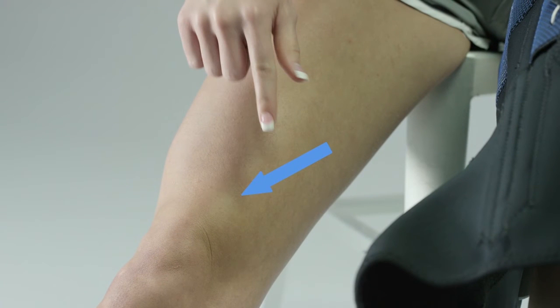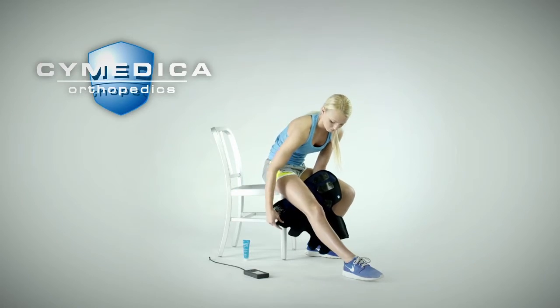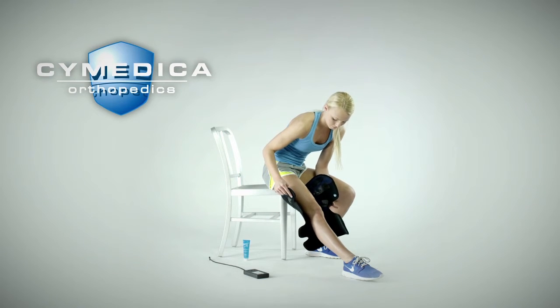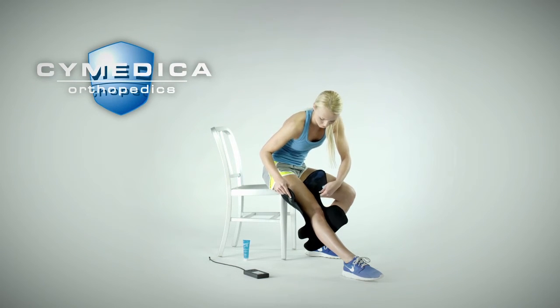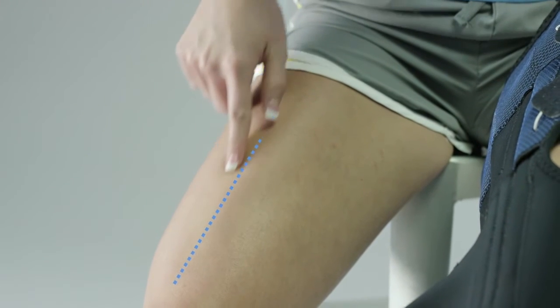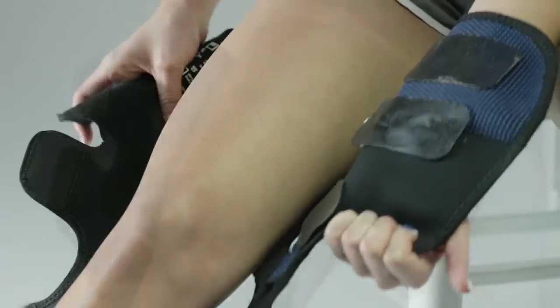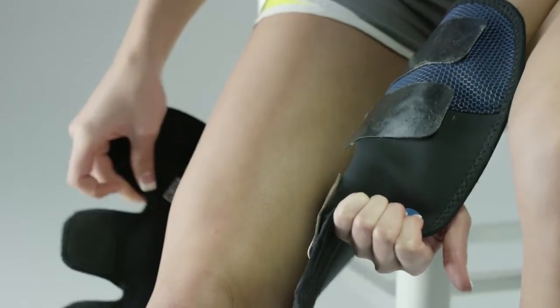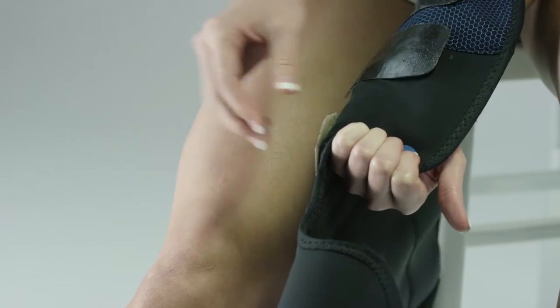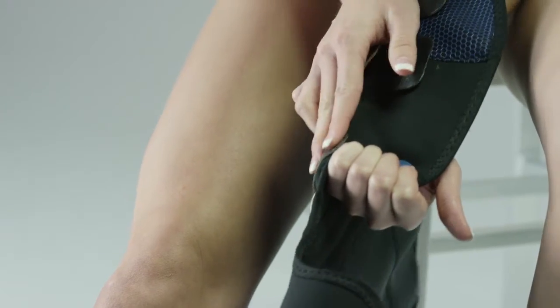The VMO electrode should be positioned towards the inside of your leg just above the patella or kneecap. Straighten your leg and flex your quadriceps muscle and palpate the VMO muscle. Verify that the VMO electrode is positioned on top of the VMO muscle belly. The common and rectus femoris electrodes should be located approximately midline on the thigh. Make sure to avoid any overlap of the electrodes and that spacing between electrodes is at least one inch. The electrodes are adhered to the conductive garment. To reposition the electrodes, peel the whole electrode from the conductive garment and adhere it in the new location desired and press down firmly.